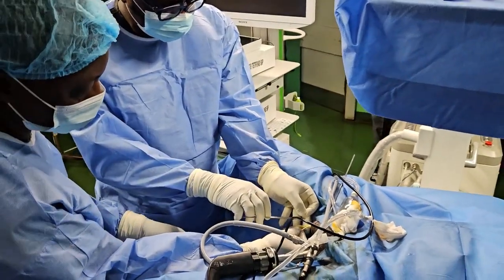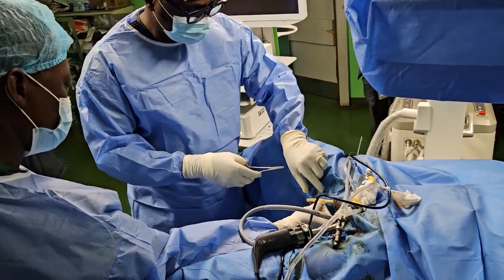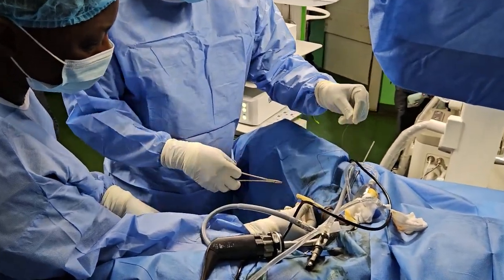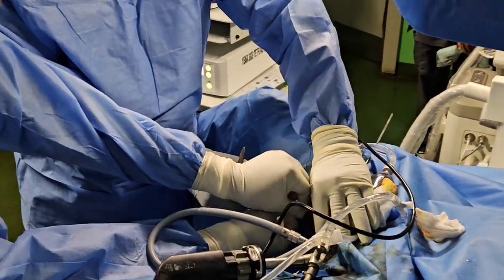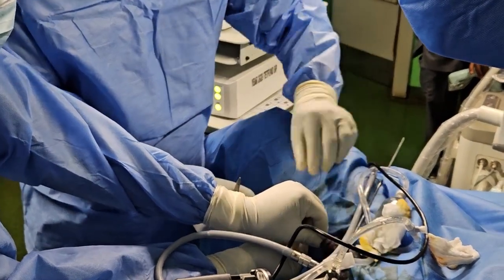You see something that looks like this, the long J stent. He has the ureteric catheter, and he's now passed the Foley catheter into the bladder. He's anchoring the ureteric catheter to the Foley so that the catheter doesn't go when the patient is turned over, rolled over. This is a very common step.